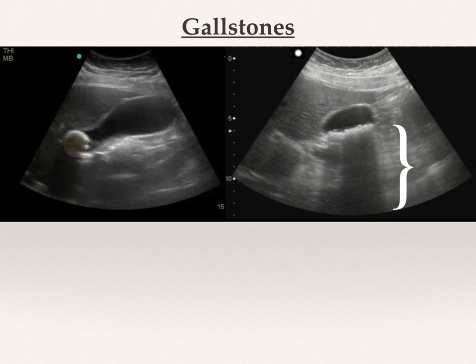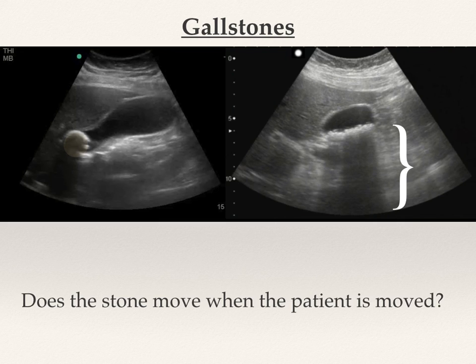If we're concerned that this would be a stone or not, the next thing that we could do is have the patient move, such as rolling onto their left side, and ask ourselves, does this stone or this object move when the patient is moved?